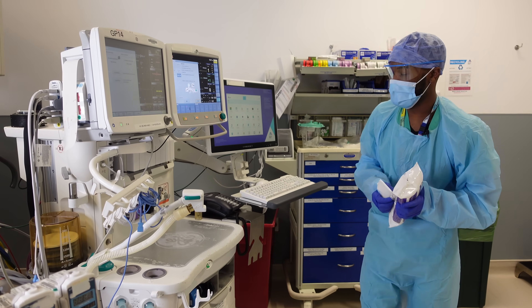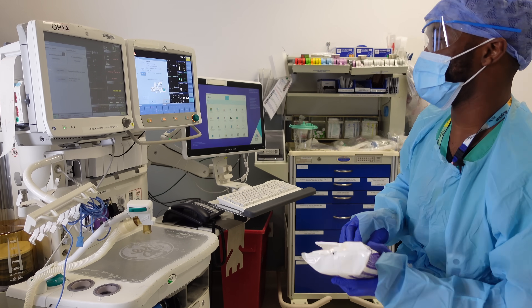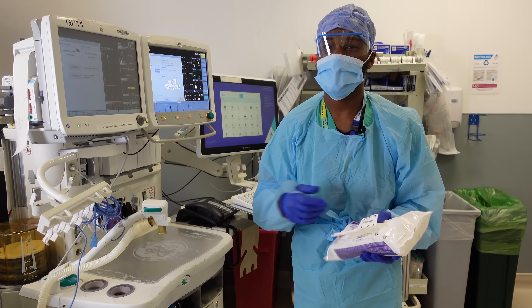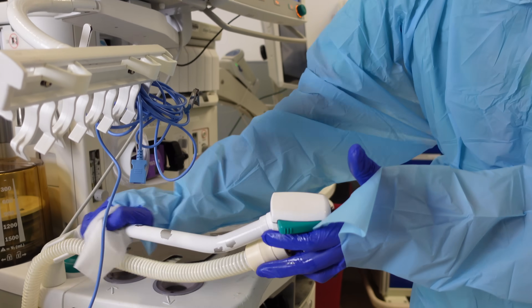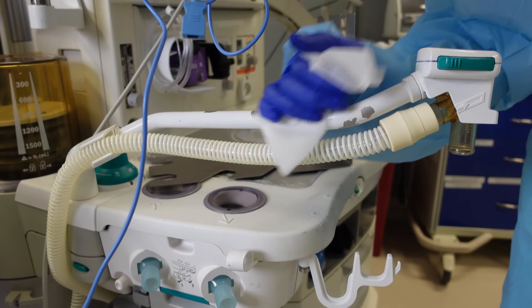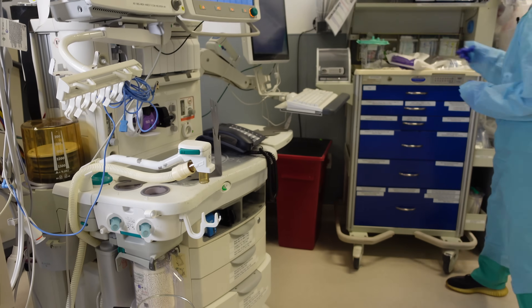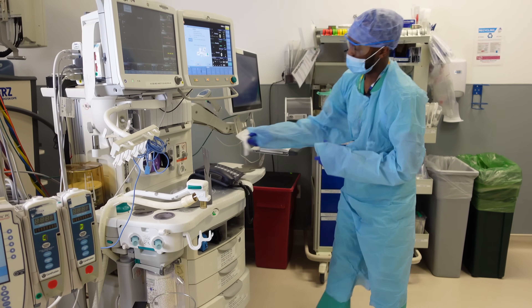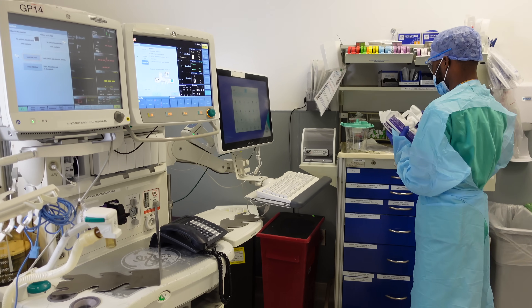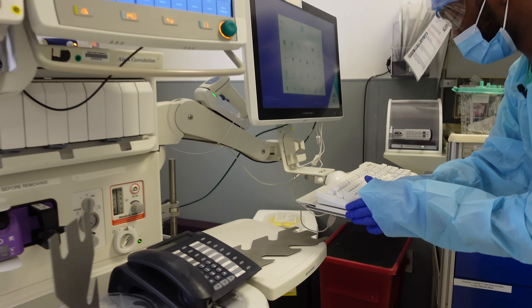Every surface on the machine needs to be wiped with one wipe — it's not like you grab a bunch of wipes and wipe all over. That's how you spread germs. Everywhere you think the doctor touches — and you might think he doesn't touch it, but he touches it, he moves it, you want to adjust it to the patient — you want to wipe everything. These little handles right here, you want to wipe the computer also, the keyboard.